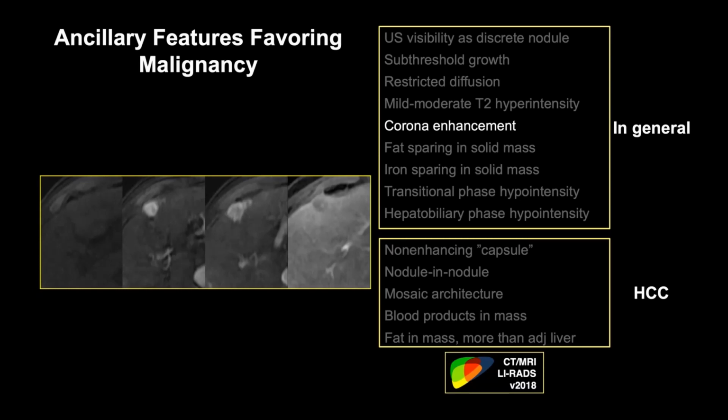These veins are destroyed as the tumor develops. Instead, HCCs drain via sinusoids and portal venules into the surrounding parenchyma. This constitutes what they call the venous drainage area, or corona. Some metastatic lesions, although, may have this peritumoral neovascularity, and thus it's not a specific finding for hepatocellular carcinoma.